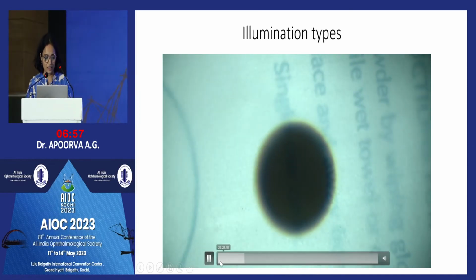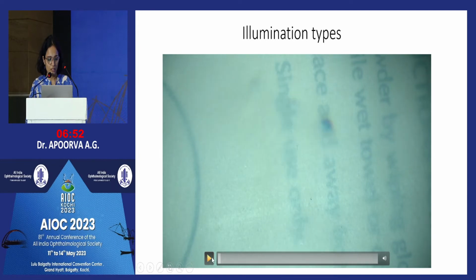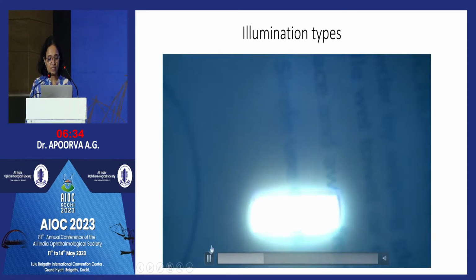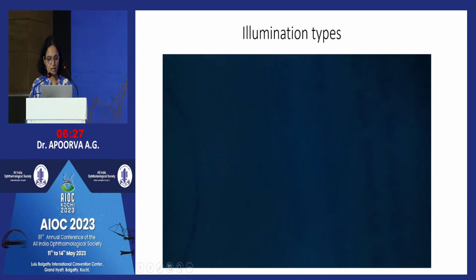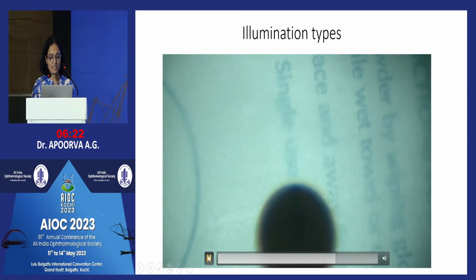These are the types of illumination. Now we can see that this is the diffuse illumination with the surroundings illumination. This is the macula protector that's going to come in. This is helpful in protecting the macula from photo damage, or photic retinopathy. This is the slit illumination. This is a broader slit and a vertical slit. And there is something called the coaxial illumination, which has 3 modes again.